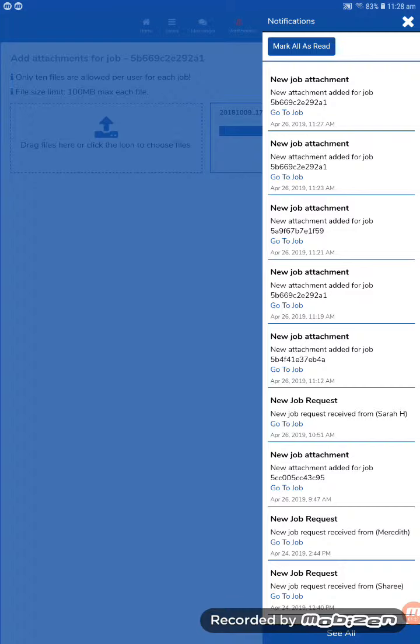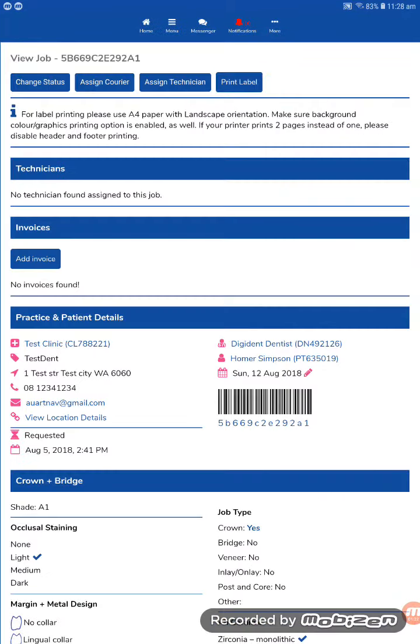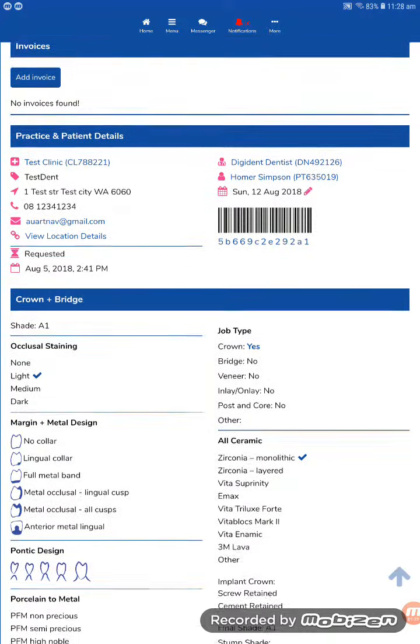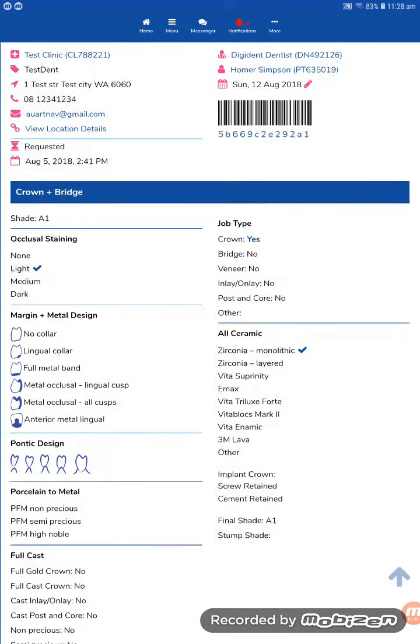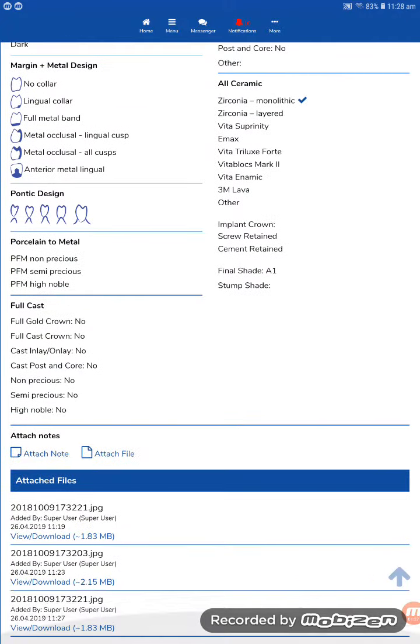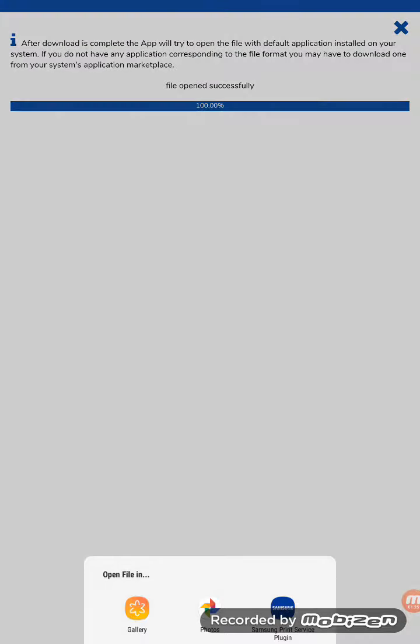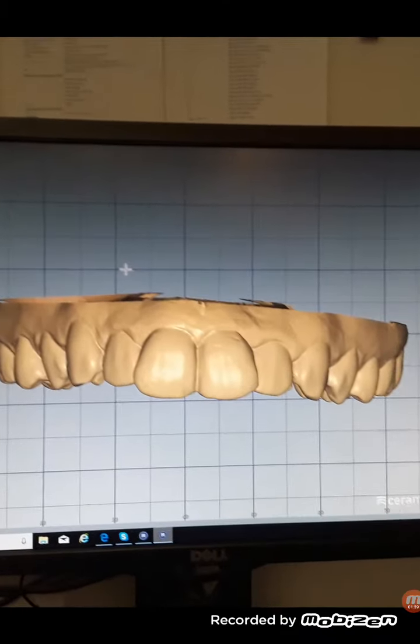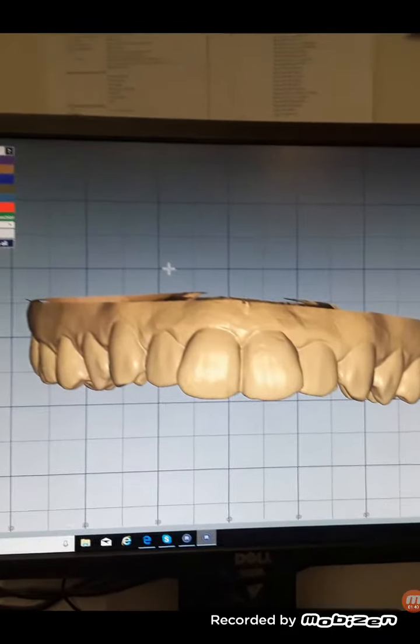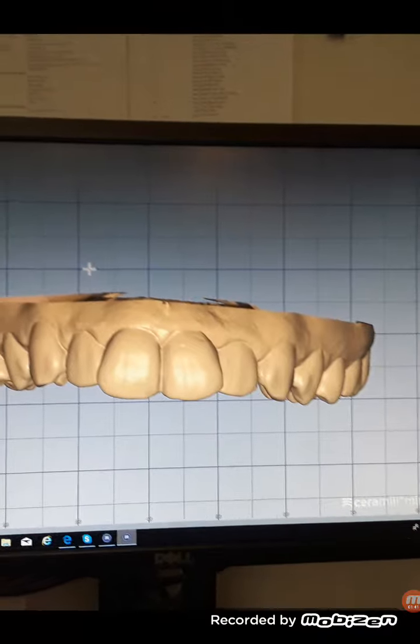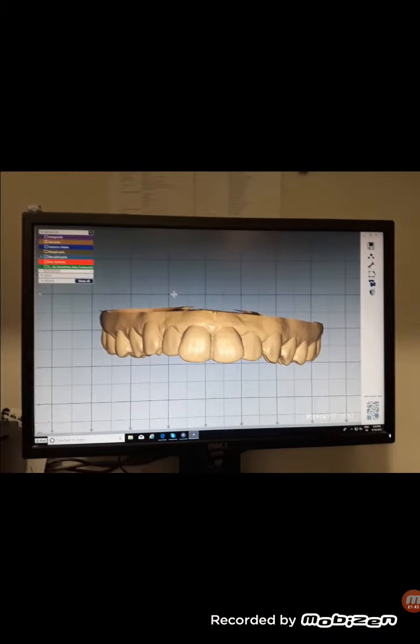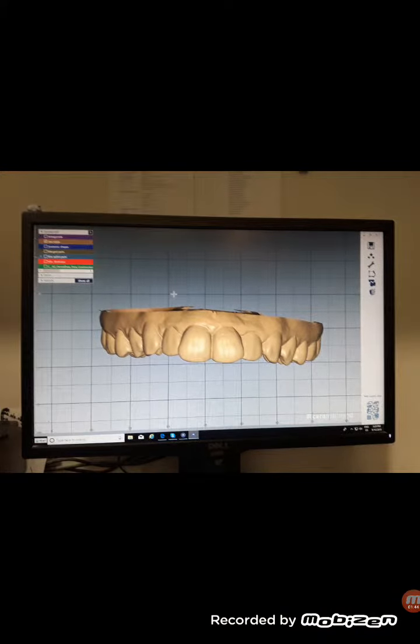So let's go to that job. So we can now see this same case. Scroll down to the bottom and we can see all the files attached to that case. And we can simply click download and open up the updated image of that case. Simple as that.